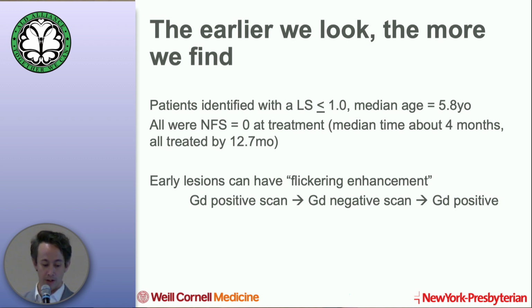So we saw this in a couple of patients, indicating that just as treated lesions will sort of flicker off as inflammation goes away, it might be the case that for some of these patients, if you look early enough and you follow them early enough, their lesional enhancement will turn on, turn off, turn on, turn off, and then turn on and stay on, which is why we look very closely at these boys over time.